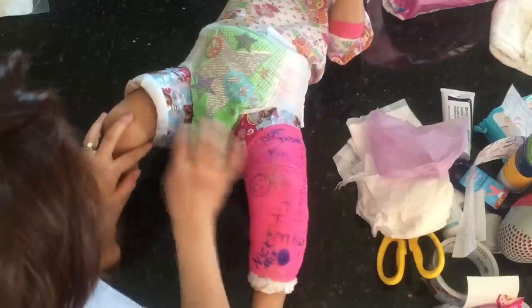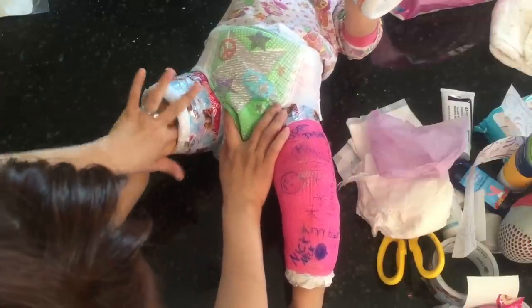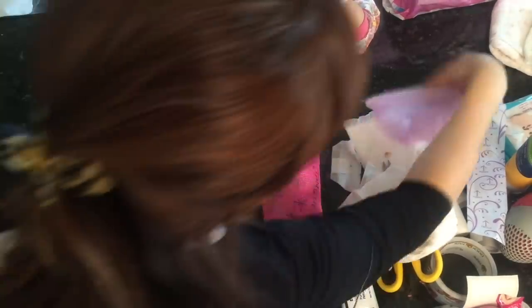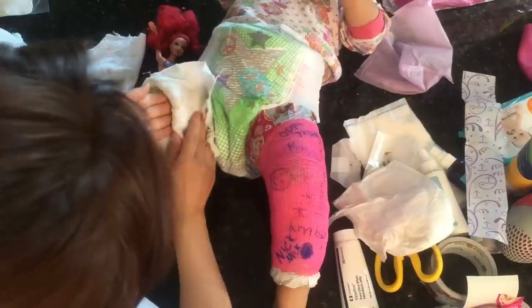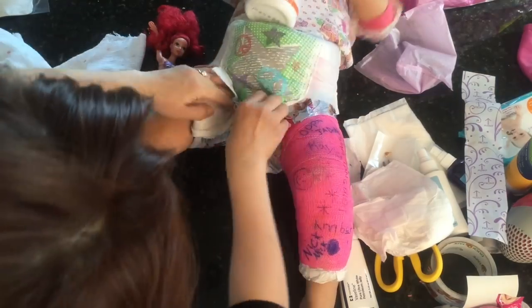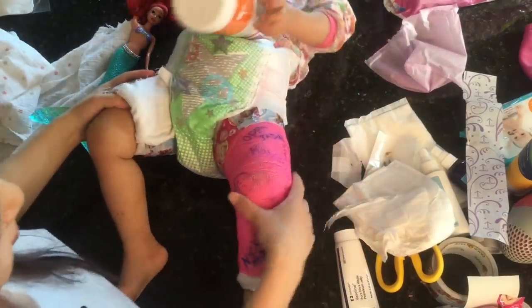Sometimes I noticed rash between the cast and the skin because it was so tight, so I'd put Vaseline or Aquaphor there. Since I didn't want her touching the gore-tex directly, I cut up a thin cloth and wrapped it around that area to give her a soft cotton layer so she wouldn't sweat as much. That's pretty much what I did for diapering throughout the whole time.